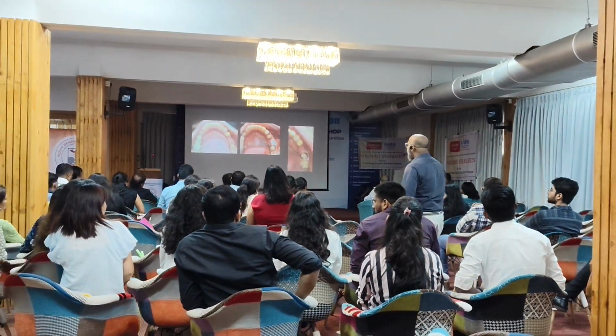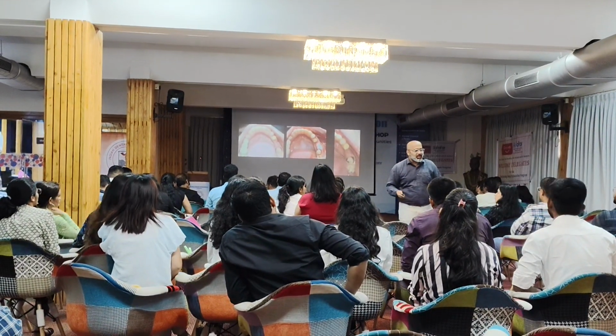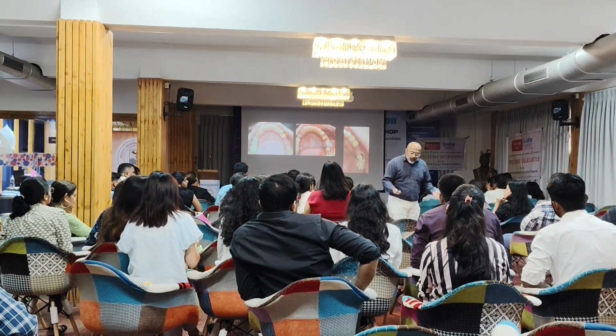So you need to plan your cases in a reverse fashion. It's called reverse engineering. Implantology is reverse engineering. You just cannot say I have a 4-6 missing and I want to place an implant. No, you cannot do that.